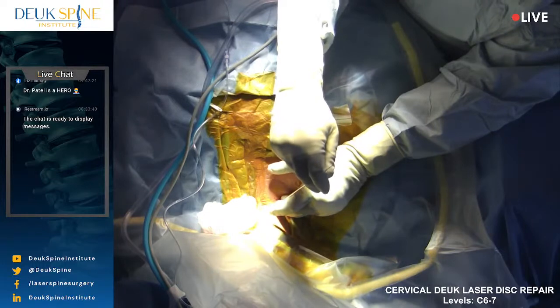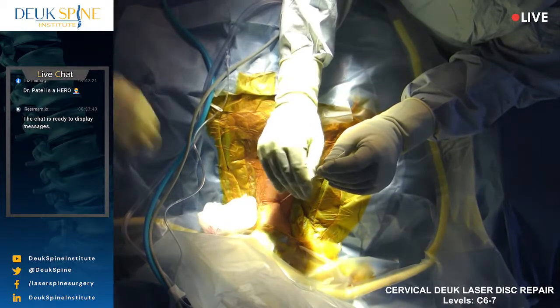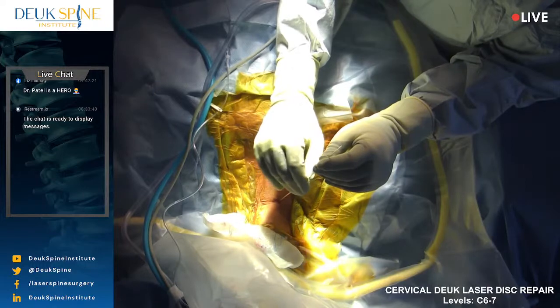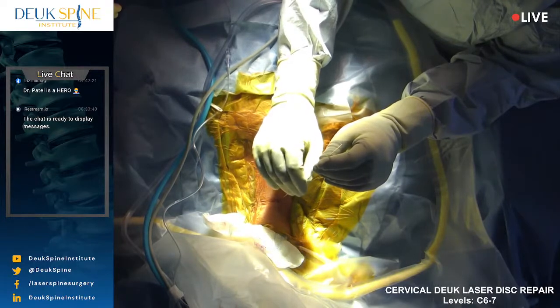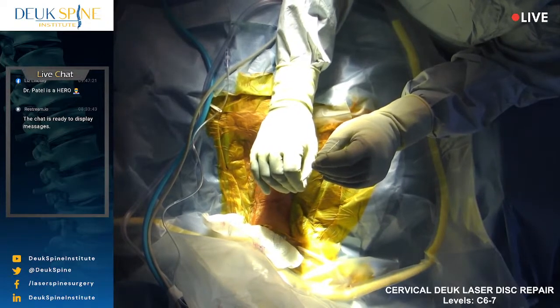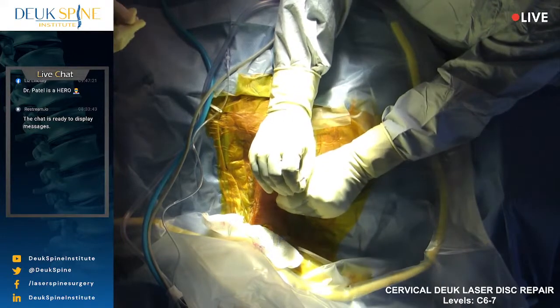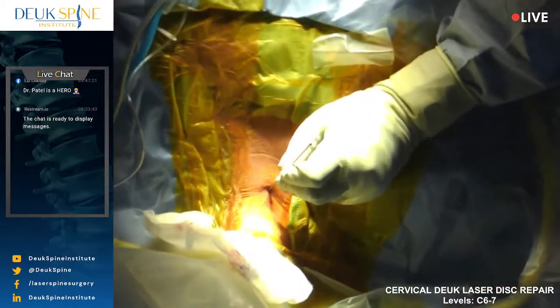But what I can do is manipulate the dilator. So I'm going to bring the dilator down to the spine. And the dilator is hard and strong. And as long as I keep this guide wire planted on the spine, it's safe to bring the dilator down. The dilator will sit right on the bone spur, and then I can maneuver the dilator. I think I'm there. Shot. Looks good. I do this manipulation all the time, but usually after I do my first disc. And then I move the dilator around the spine.